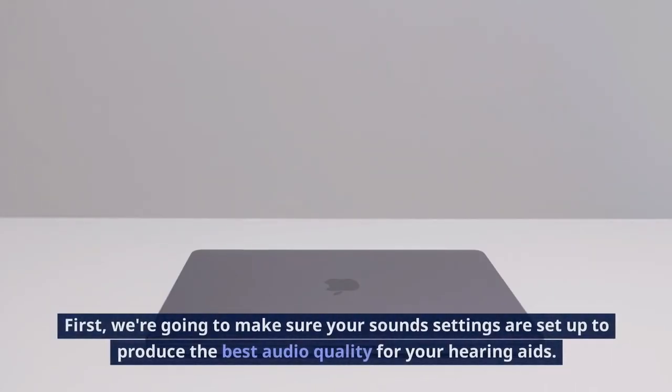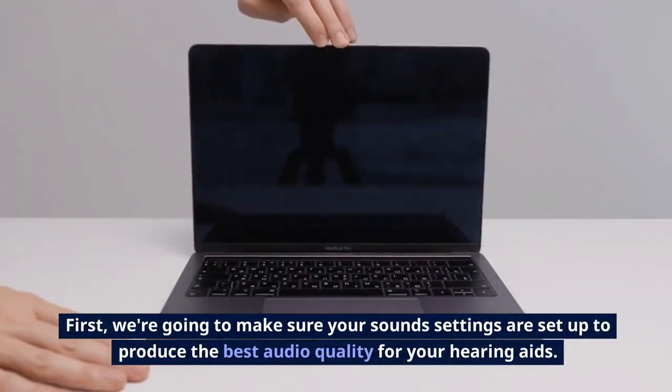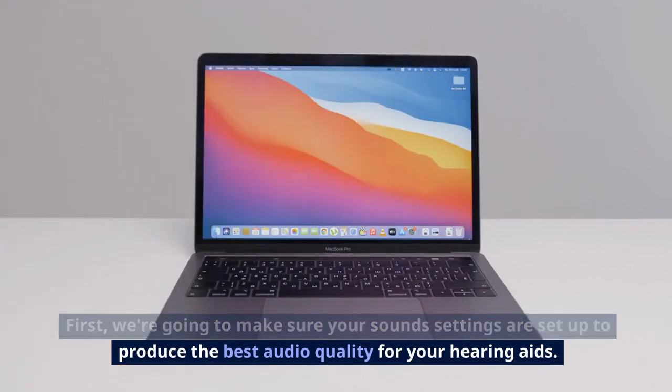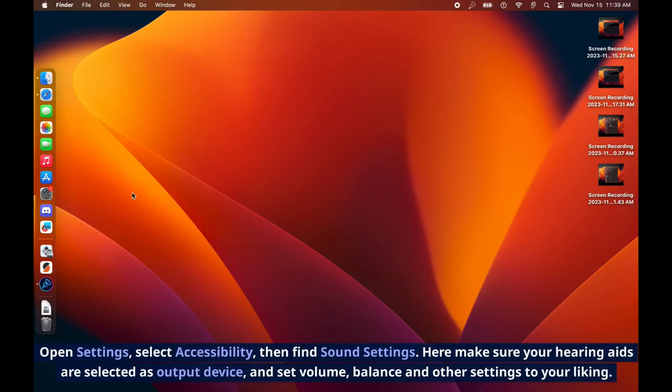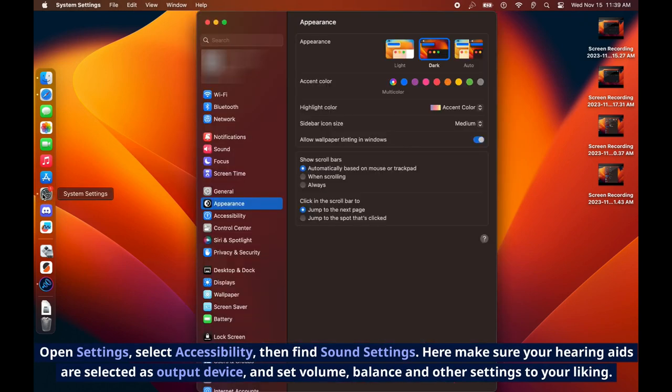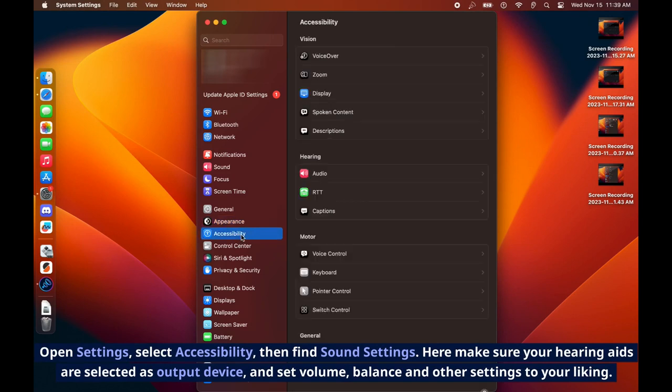First, we're going to make sure your sound settings are set up to produce the best audio quality for your hearing aids. Let's open Settings, select Accessibility, then find Sound Settings. Here make sure your hearing aids are selected as output device and set volume, balance, and other settings to your liking.